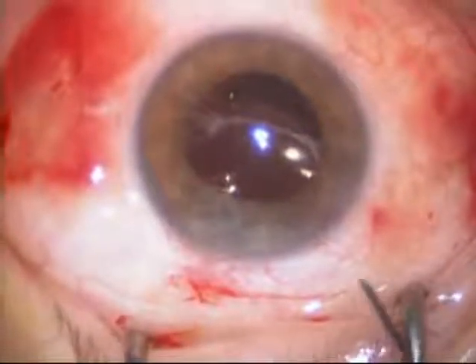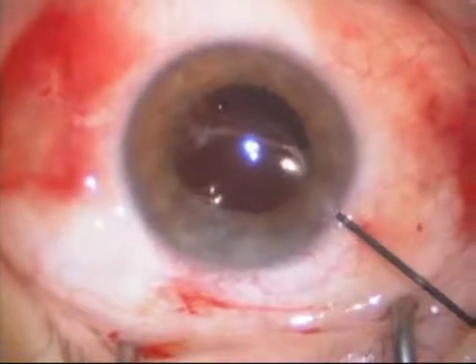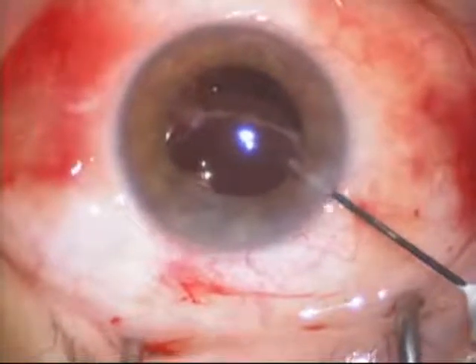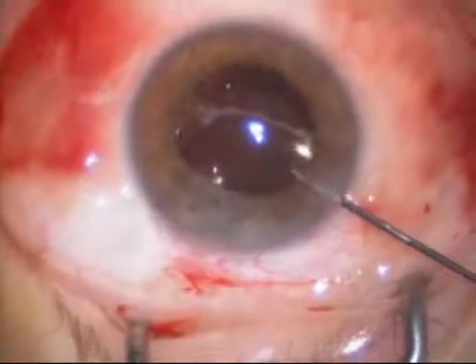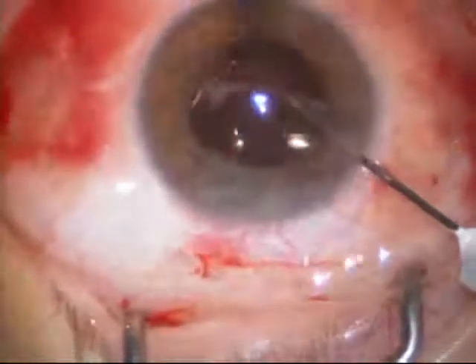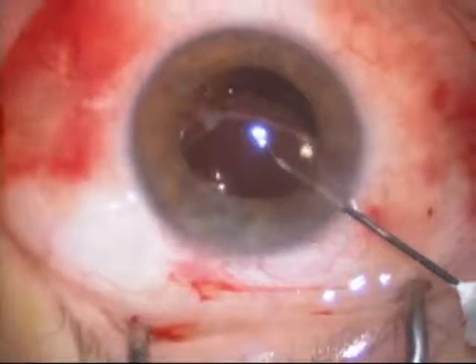At this point the lens has been stabilized and tucked into the capsule. The trocars have been removed. What I'm doing here is washing the viscoelastic out of the front of the eye to avoid any problems with pressure after the surgery. We then inject an antibiotic at the end of the surgery. I hope you found this video instructive, and we'll take time to look at other videos and informational sheets on this website. Thank you for your attention.